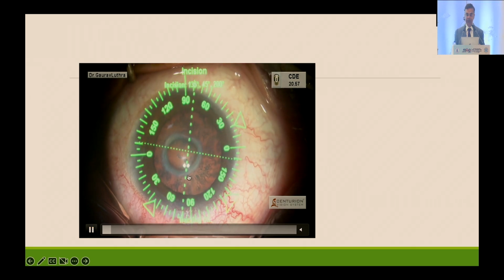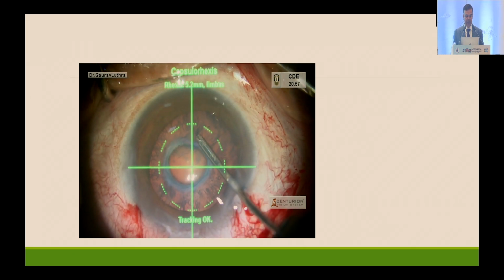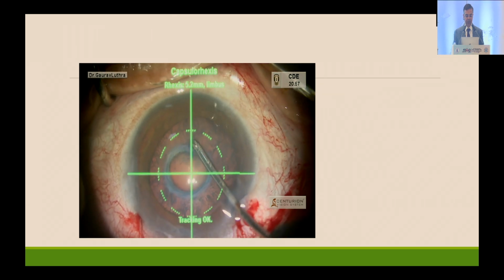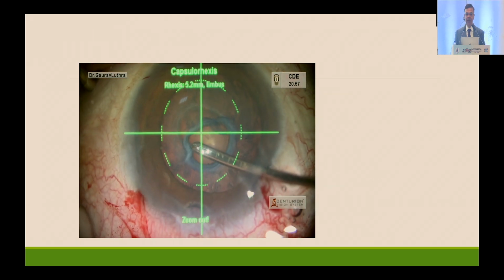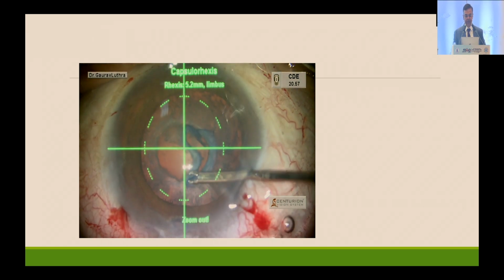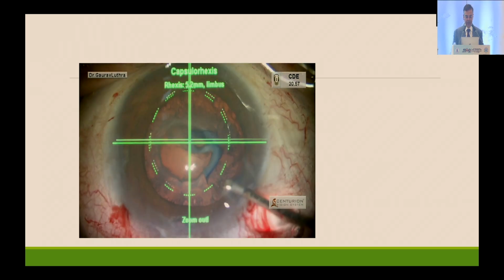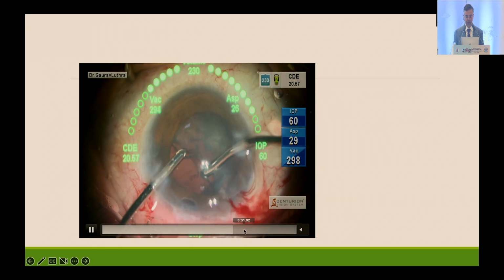And these surgeries can be very challenging. These lenses are very friable, and you can see that big ring-like break which has happened. Once we removed the ICL, we saw this fibrotic ring. Patient was trying to decide whether to get the ICL out or not. Wasted almost 15-20 days, and by that time the lens had totally gone like this. So we eventually managed, and got the surgery through.